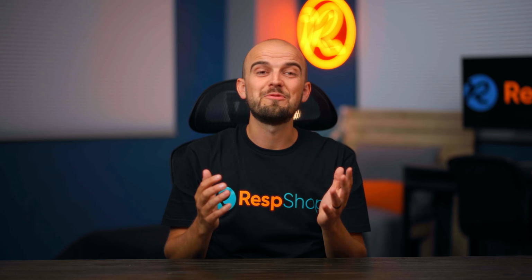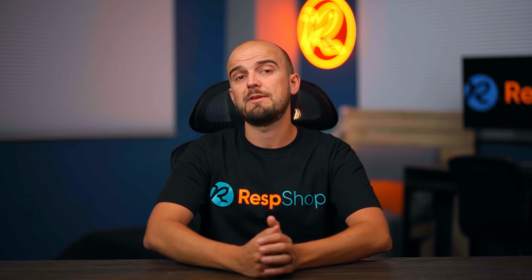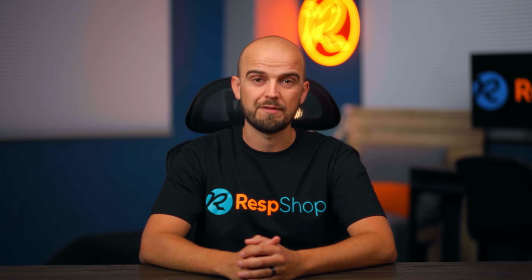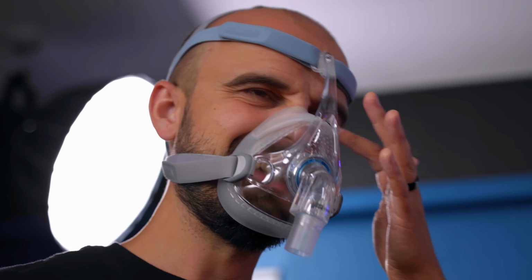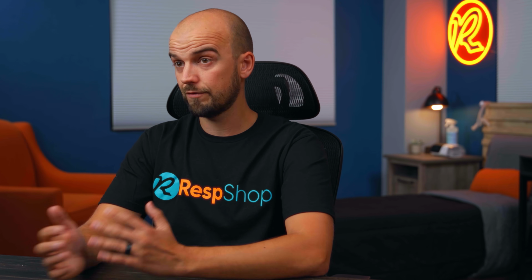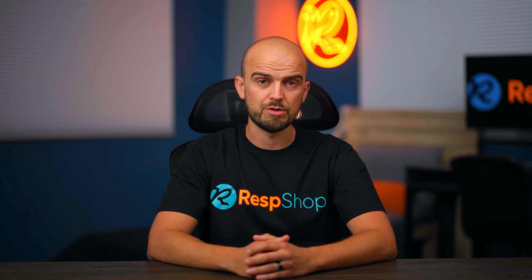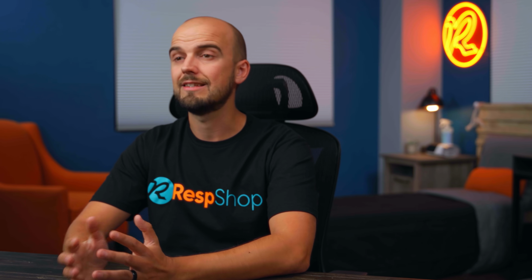Problem 5, general discomfort. Now, if we were meant to wear masks while we sleep, we would have been born with them attached to our faces. So no matter what you do, there's no escaping the fact that this isn't quite the natural way of things, and there will probably be some discomfort, especially in the beginning. But that doesn't mean you can't do some things to help. If you're a new user of CPAP, you may be suffering from claustrophobia. This is very common with new users. Also, the very fact of trying to sleep with all this new equipment on and around you can make it harder for you to relax and enter a sleep state.